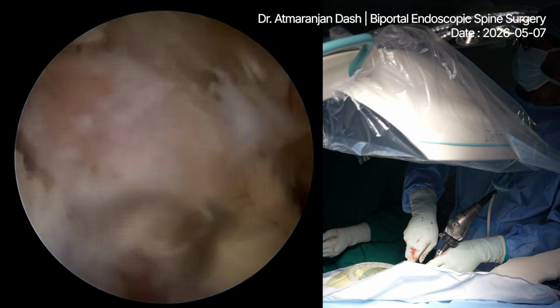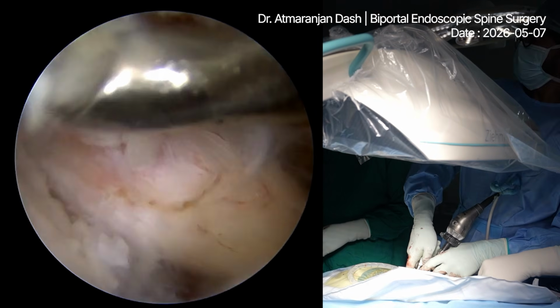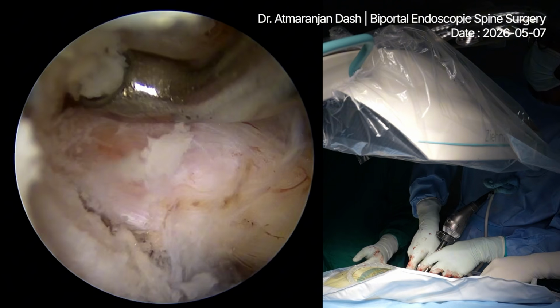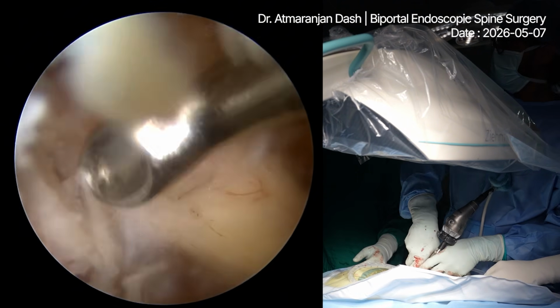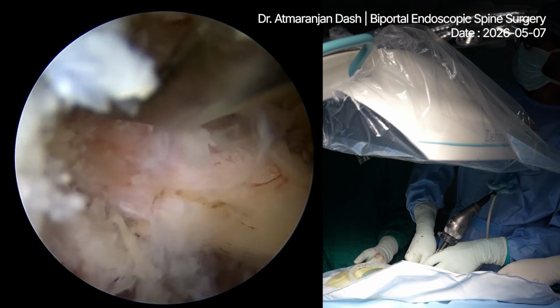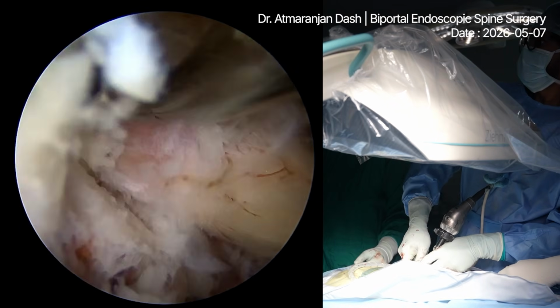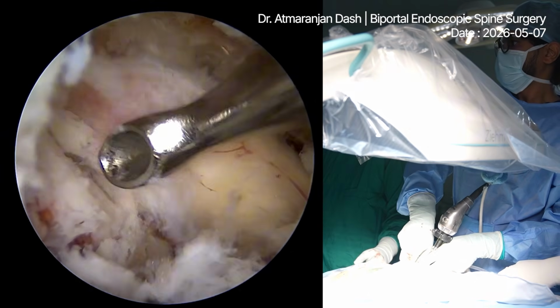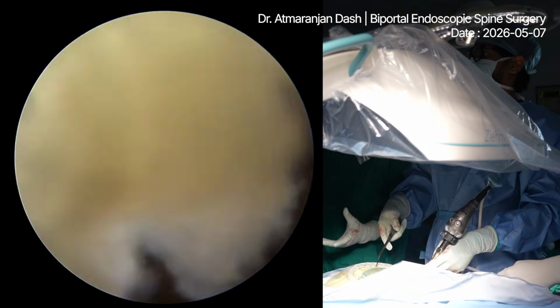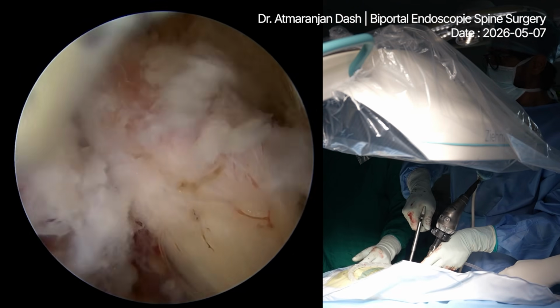Okay, very good. Okay. Epidural fat has come, huh? Okay. Curved, a little more curved.